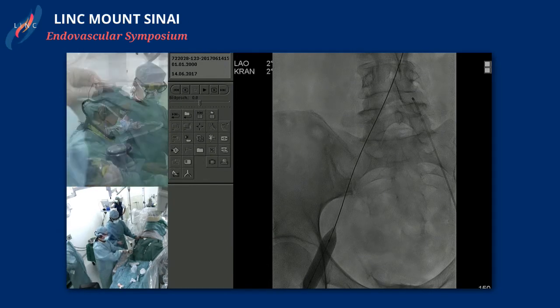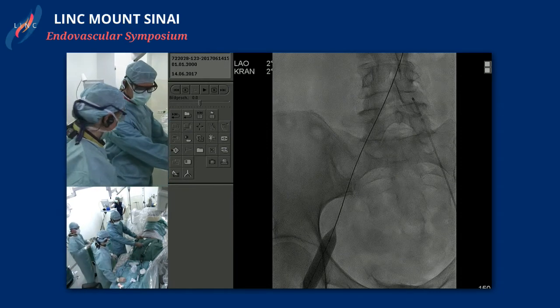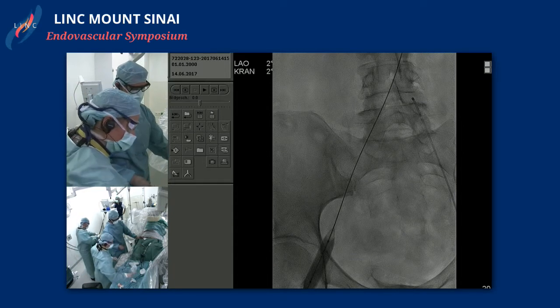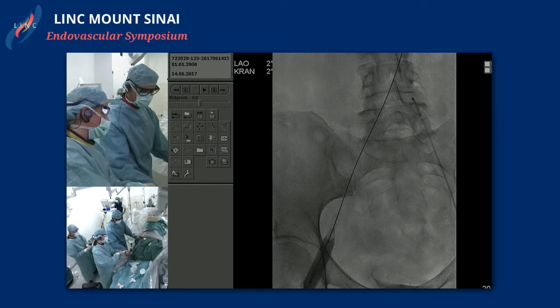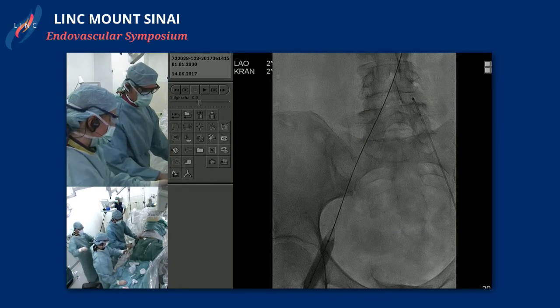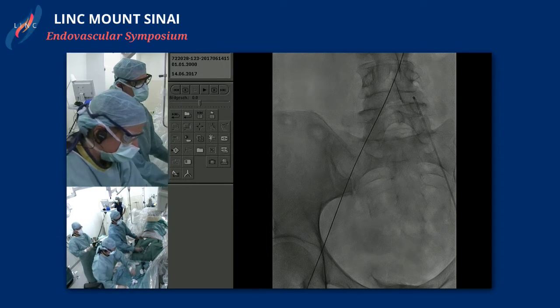Okay. Could you describe what you would consider to be a venous stent that is a little bit more flexible than the sinus stent that you would think about putting in the external iliac vein here? I'm not sure whether I really got your question.